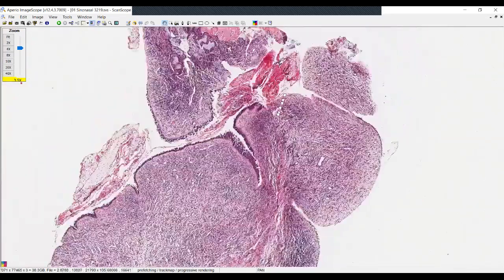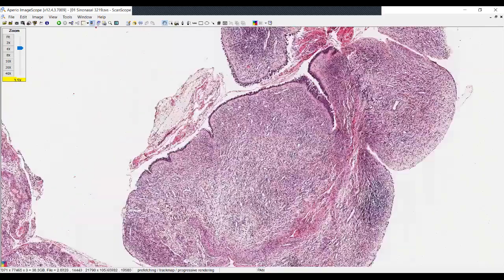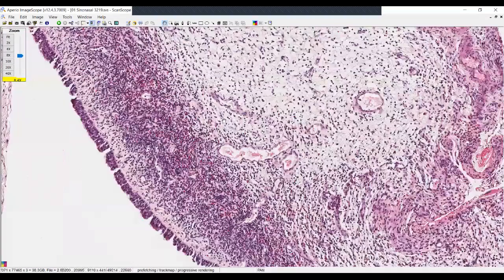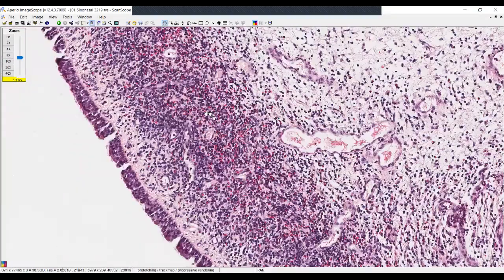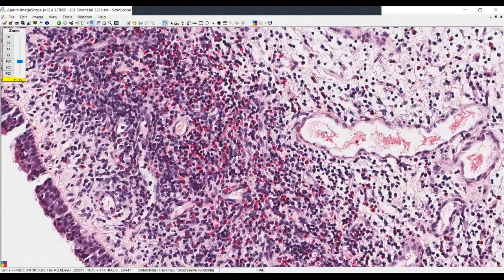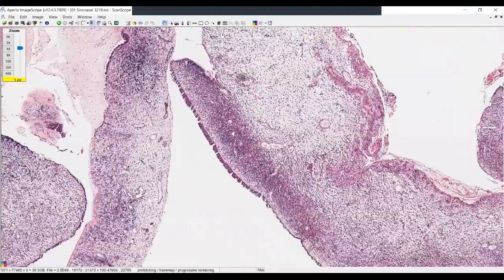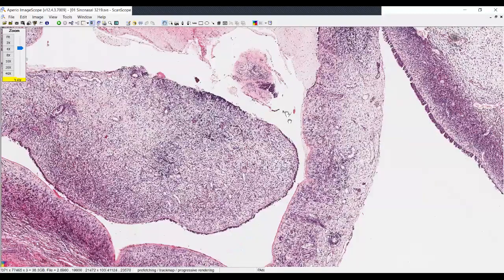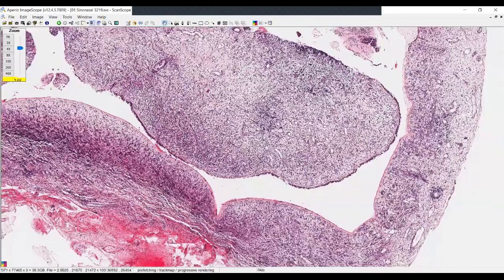I think that you can tell this is a very easy space to examine as just regular old inflammatory sinonasal polyps. I often go to look at high power just to get a better idea of exactly what may be going on with the inflammatory infiltrate as a predominant cell type. And in this case, I think that the eosinophils are the predominant cell type. Sometimes this can be of value to your clinician as they try to manage recalcitrant inflammatory polyps, and they may ask if there is an eosinophilic heavy infiltrate.